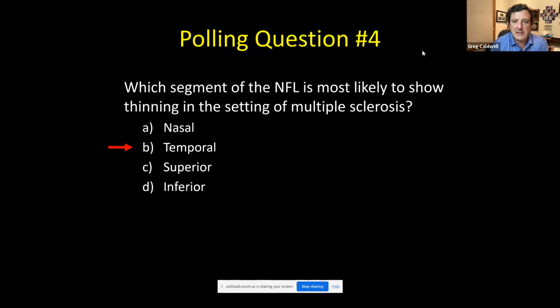So neurology and OCT, that's a really good question. It is becoming much more popular. I think that in the areas where you have academic medical centers, to a large extent, it is part of standard of care.